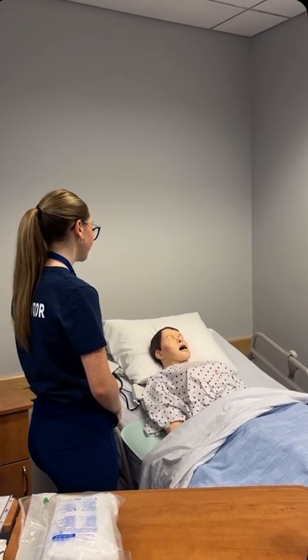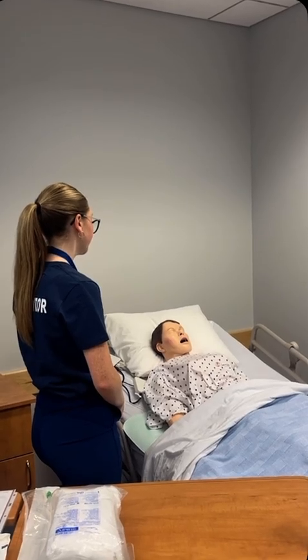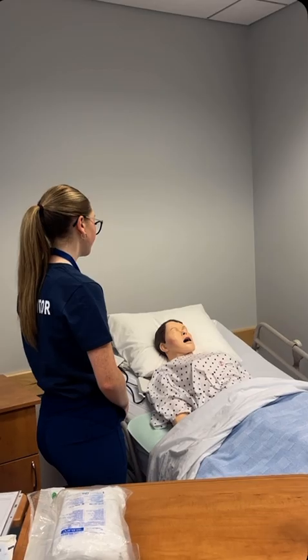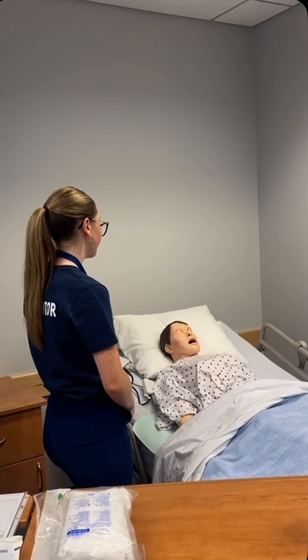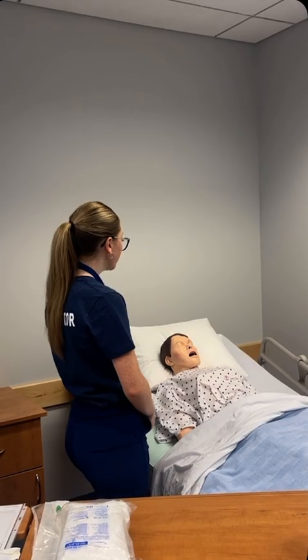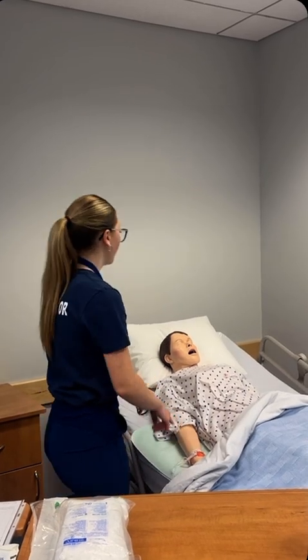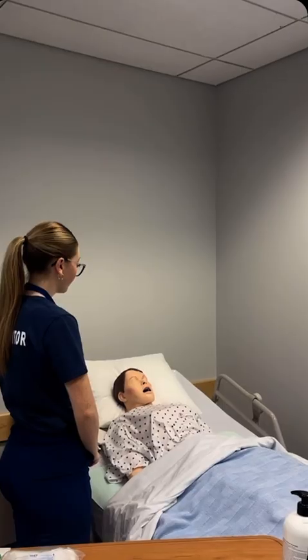Check patient's armband or chart for allergies and confirms by asking the patient. This can include latex, betadine, shellfish, cleansing solutions, and tape. Do you have any allergies I should be aware of? I noticed an allergy alert band here. I'm just going to compare it with your order and your chart.